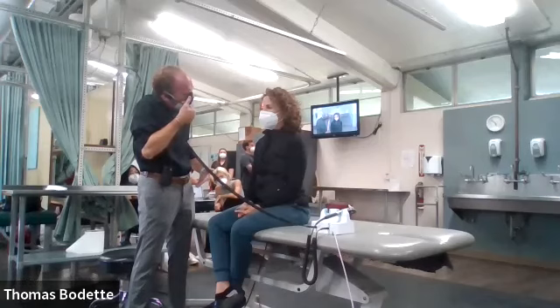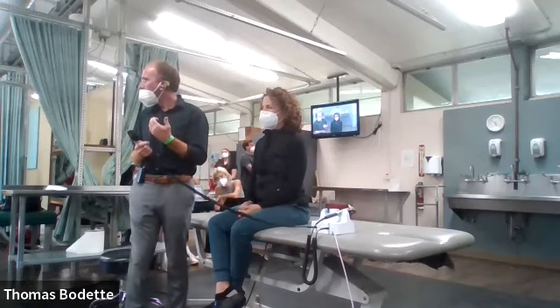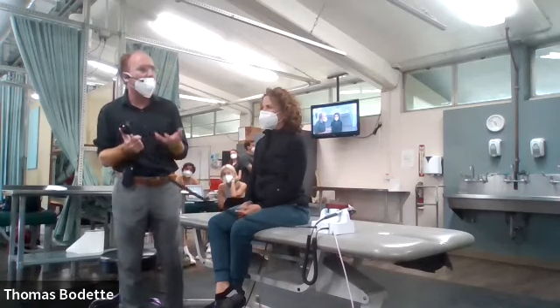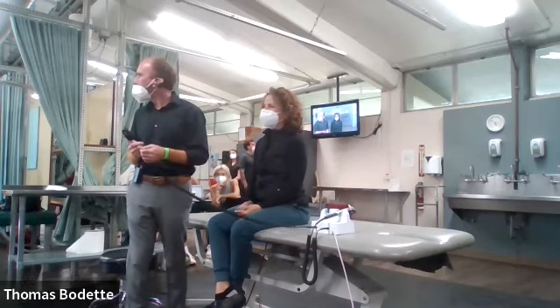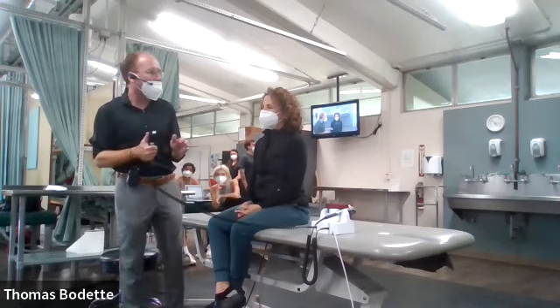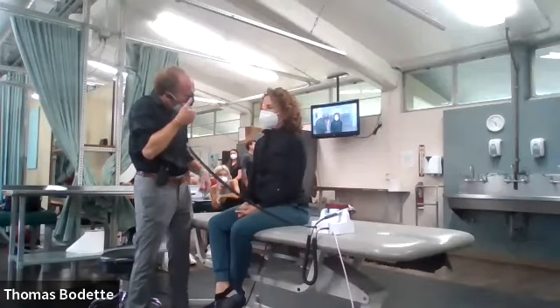If you do not, that could mean one of two things. Number one, it could be a nuclear cataract, which is obstructing that light from hitting the retina, or it could be an eye prosthesis. Maybe they had a retinoblastoma or another severe trauma to the eye that required a prosthetic eye. Make sense? So that's the very first abnormality that you want to look for. Now, once you see that red, then you're going to be coming in at that angle.